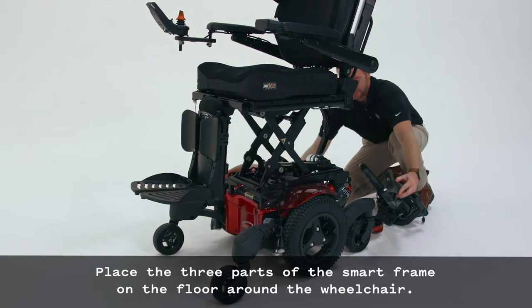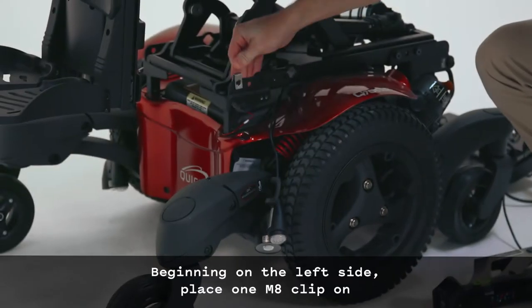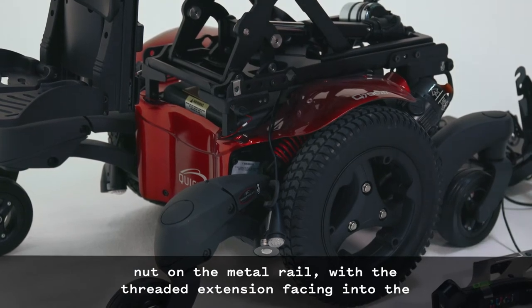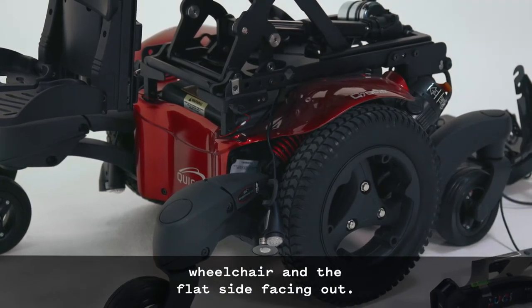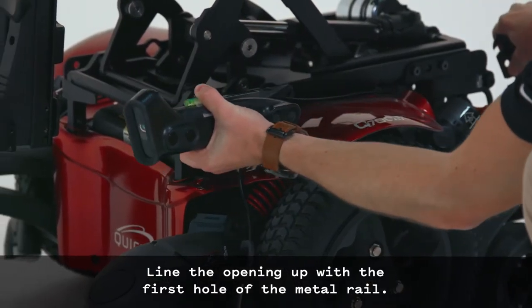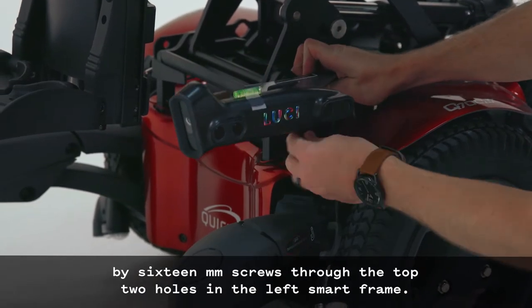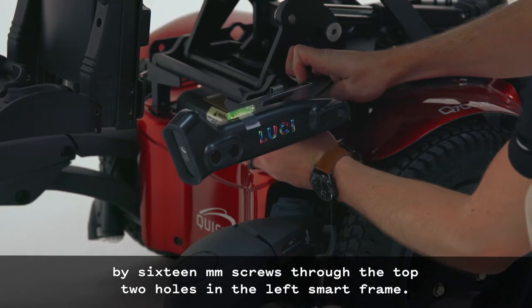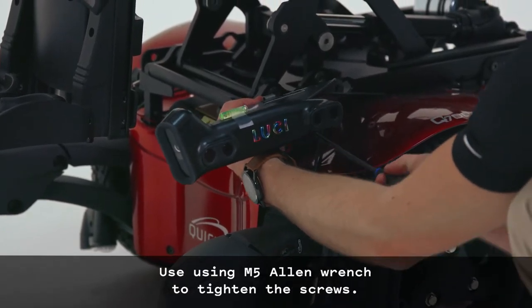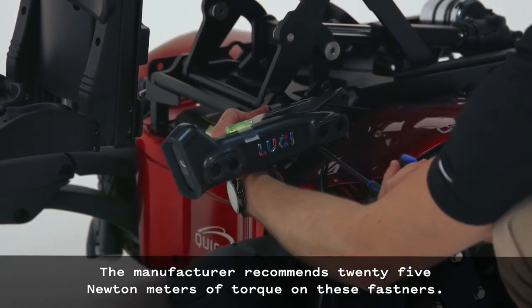Place the three parts of the smart frame on the floor around the wheelchair. Beginning on the left side, place one M8 clip-on nut on the metal rail, with the threaded extension facing into the wheelchair and the flat side facing out, aligning with the first hole of the metal rail. Attach the left smart frame to the wheelchair base with two M8 x 16mm screws through the top two holes. Use an M5 Allen wrench to tighten the screws. The manufacturer recommends 25 Nm of torque on these fasteners.